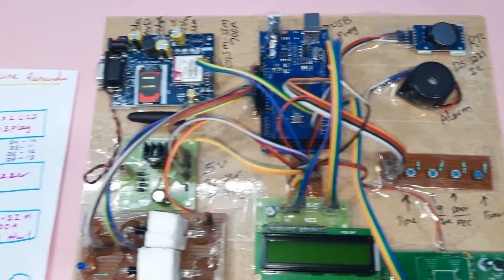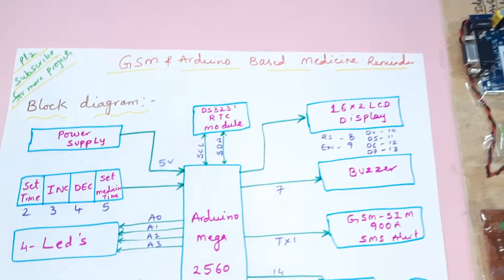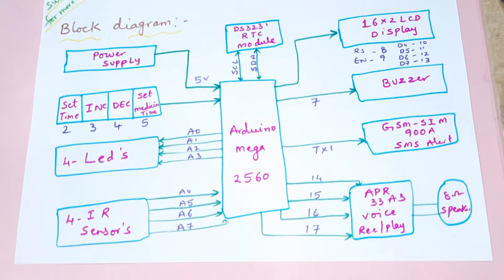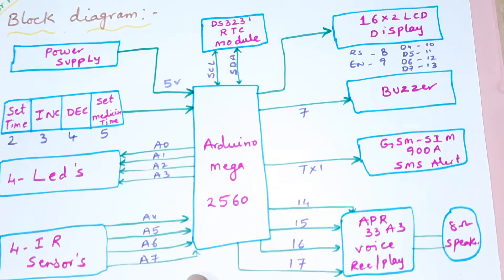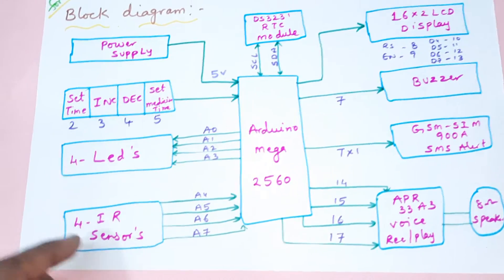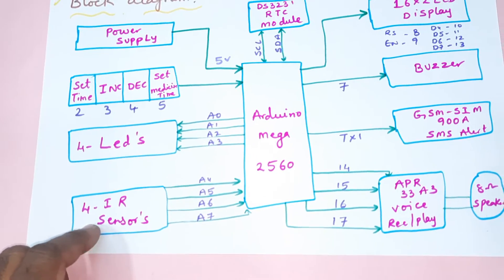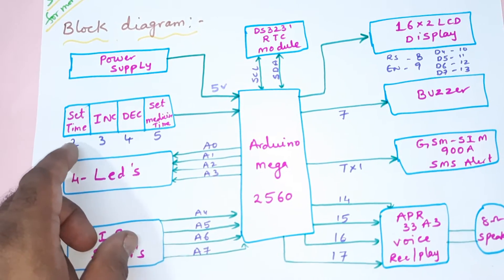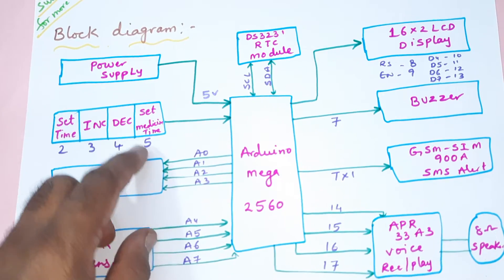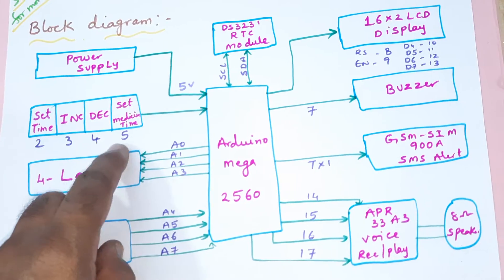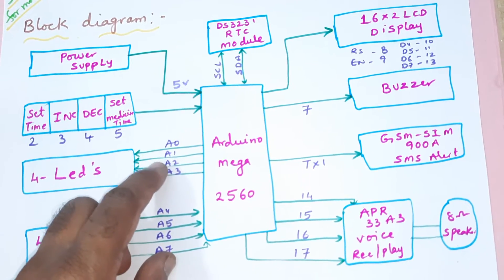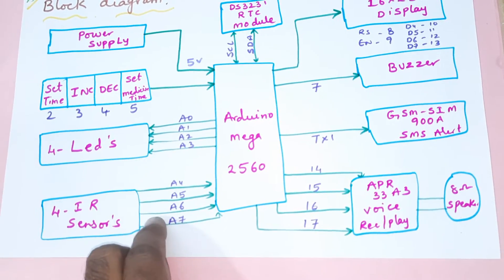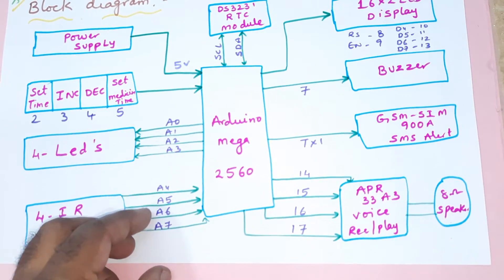Hi, we are from SVSM. The project title is GSM and Arduino-based smart medicine reminder. In this project we are using an Arduino Mega 2560 board. There are four IR sensors, four IR LEDs, and four switch buttons: set time, increment, decrement, set medicine time. These are connected with pins 2, 3, 4, 5 and A0, A1, A2, A3. Four LED indicators and four IR sensors are used for medicine taken or not representation, connected to A4, A5, A6, A7.